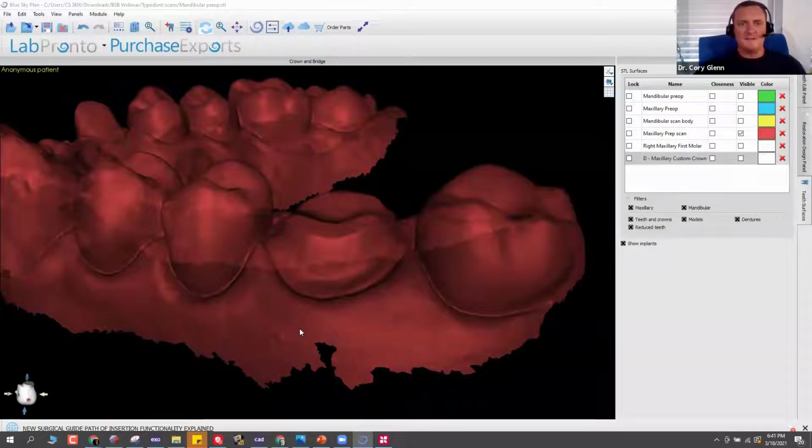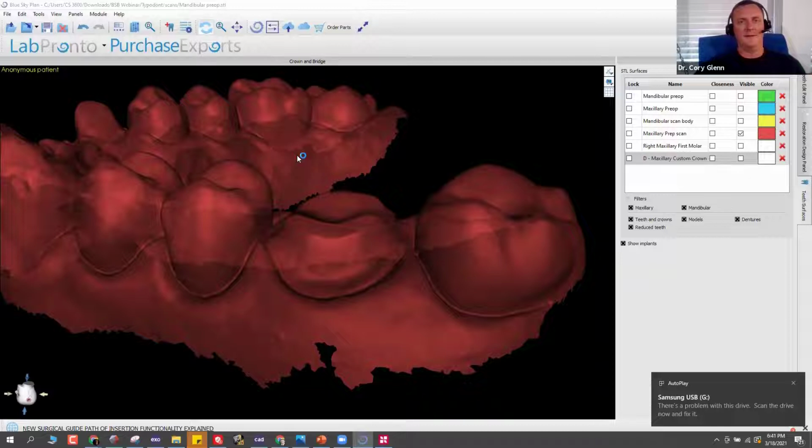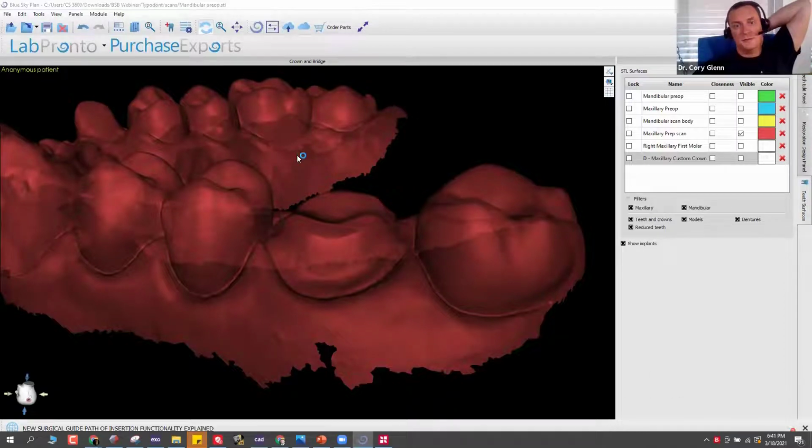Are the printable resin physical properties as good or better than light cured direct composite? They definitely are. These things are insanely strong. The light cure composites I've used could not hold up to the same level of abuse that these things do.